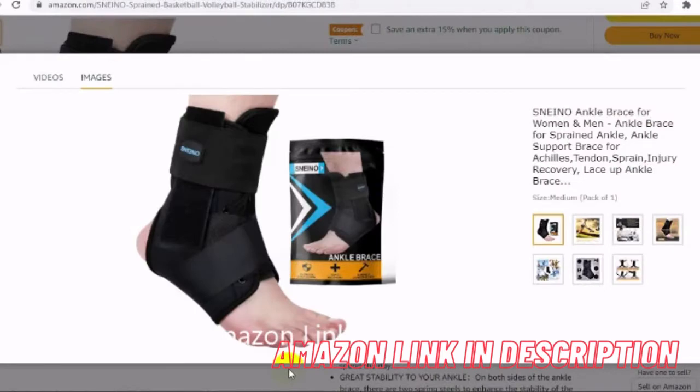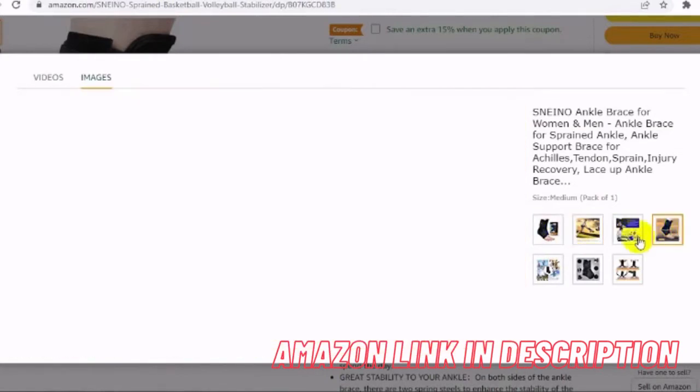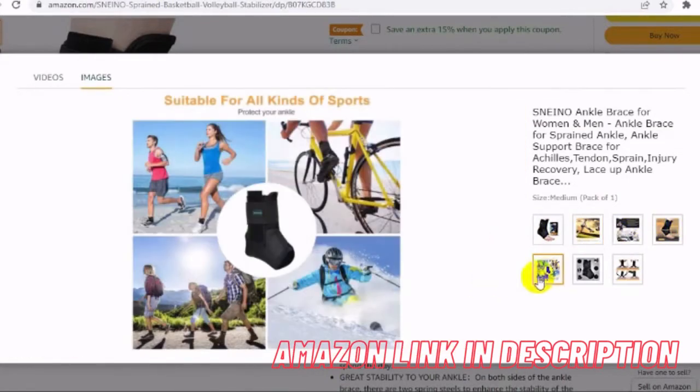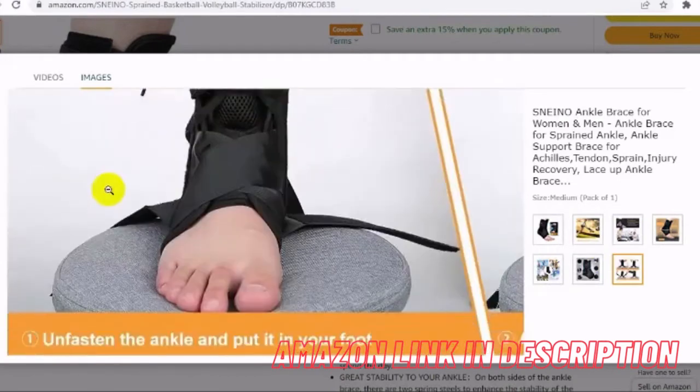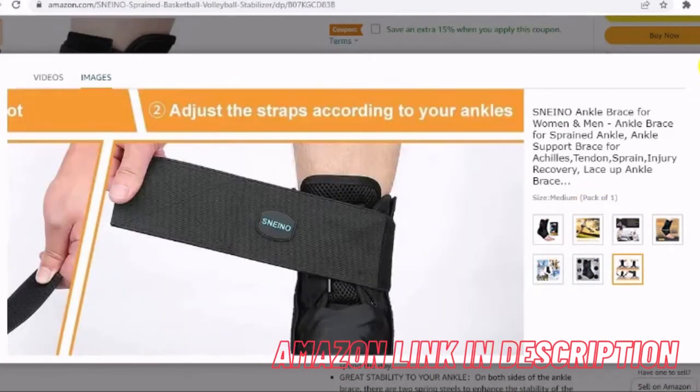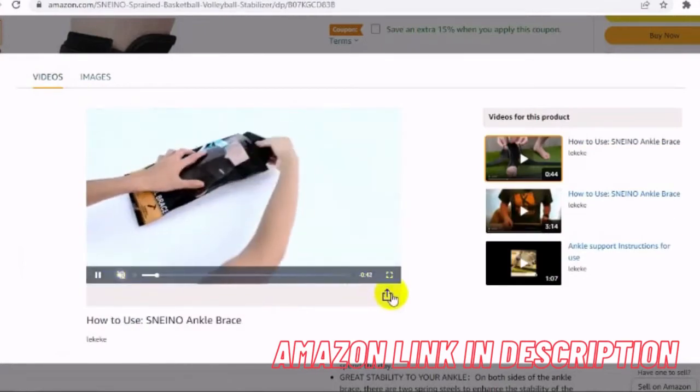Sneino ankle brace — upgraded 360-degree around-the-ankle support stability. Made of neoprene, elastic, durable, breathable, comfortable, and quick-drying, so you can wear the ankle stabilizer comfortably all day. On both sides of the ankle brace there are two spring steels to enhance stability. The ankle support bracket is also designed with two stabilizing straps to further enhance ankle stability, helping you recover from injury and prevent future injury.